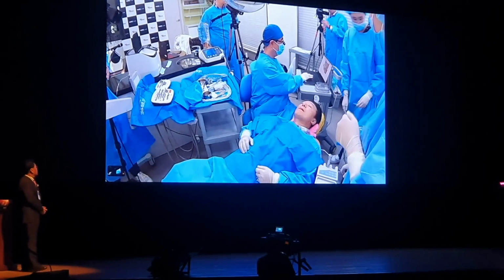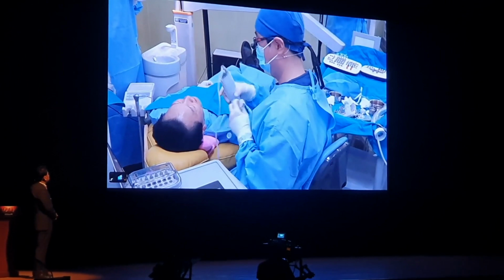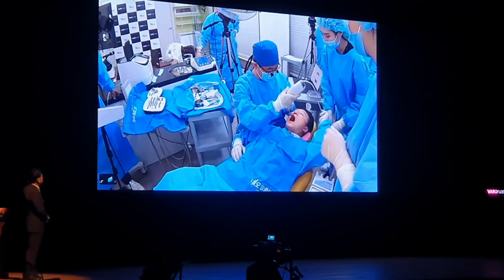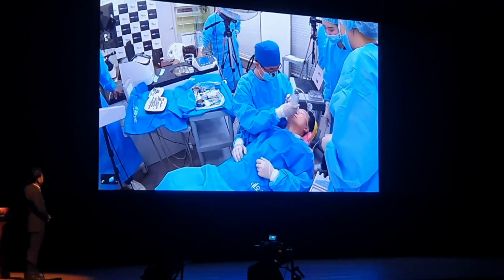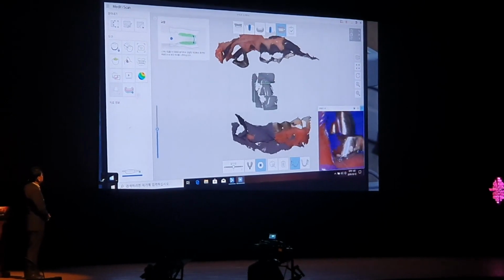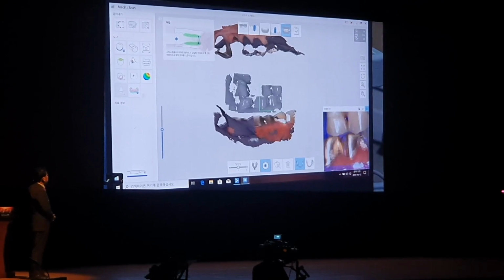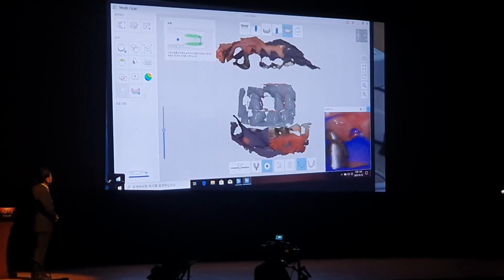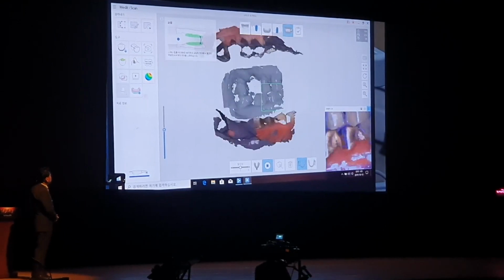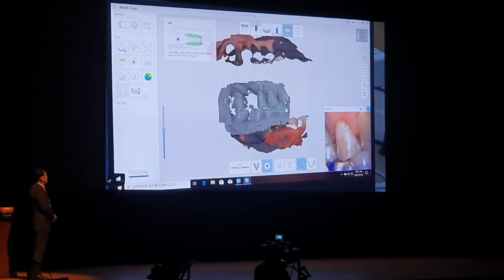Now before I scan the scan body in the maxilla, I'll first scan the occlusion, like a lateral wide shot. Open your mouth, please. Open. And now close your mouth. So I'm going to start the scanning of the occlusion, lateral wide shot. So now we scan the occlusion.